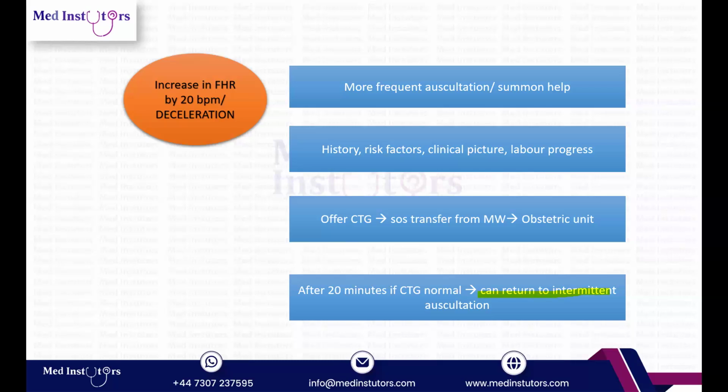Okay, am I clear so far, guys? Are you understanding the whole concept for low risk women? We stick with intermittent auscultation. But if on intermittent auscultation we find a baseline shift of more than 20, or a deceleration, then we would do these steps.